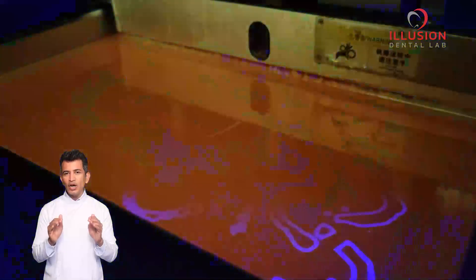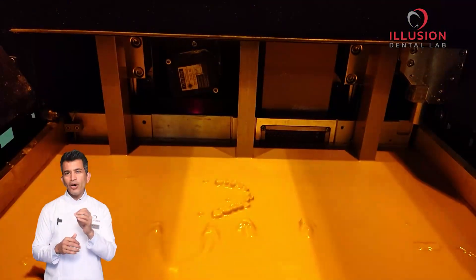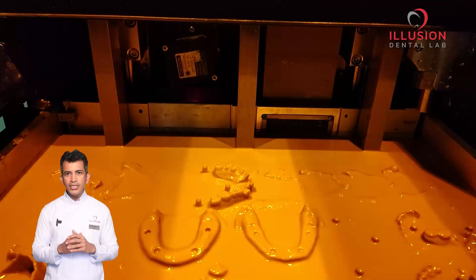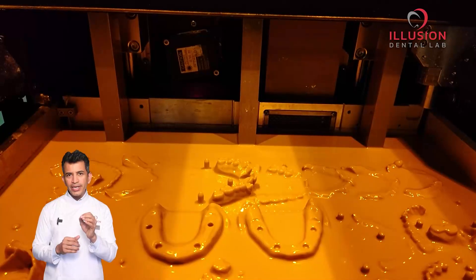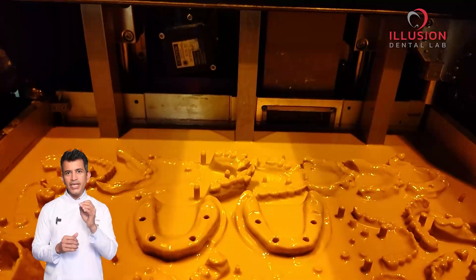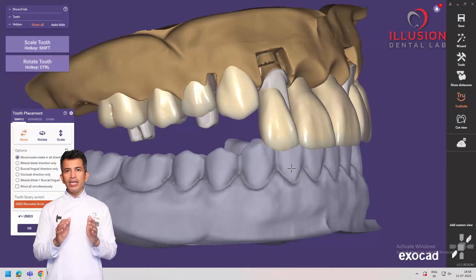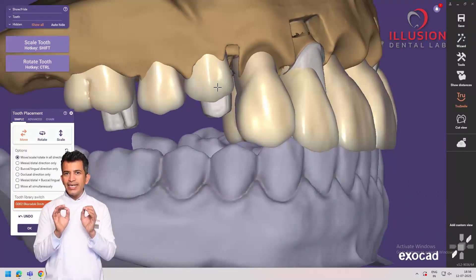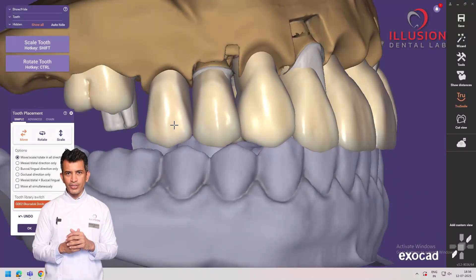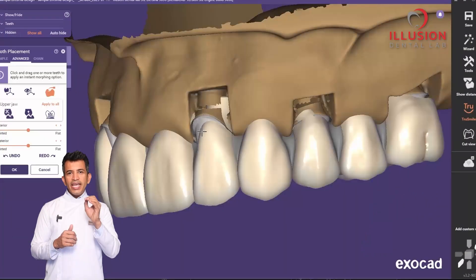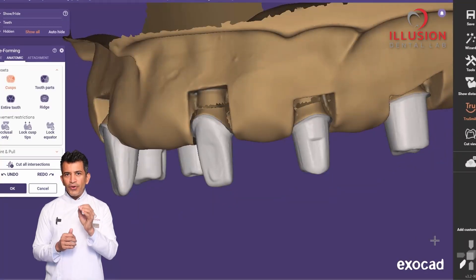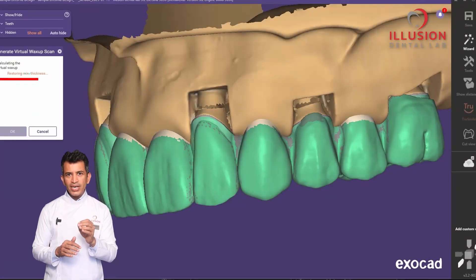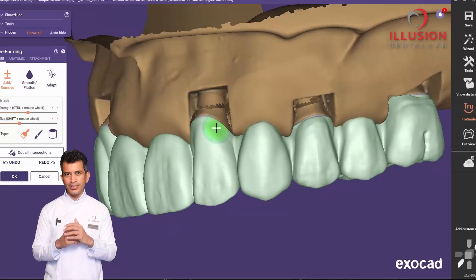Once the design is ready, we move to 3D printing of the implant model. The model is 3D printed with a high precision printer ensuring the exact replica of the intraoral scan. Meanwhile, the prosthesis is digitally designed with great anatomy and perfect occlusion. Every detail is designed to function seamlessly, crafted to function like a crown and bridge on implants.